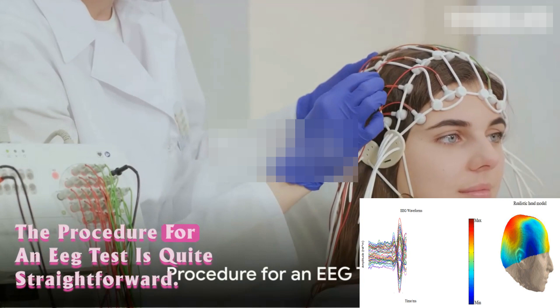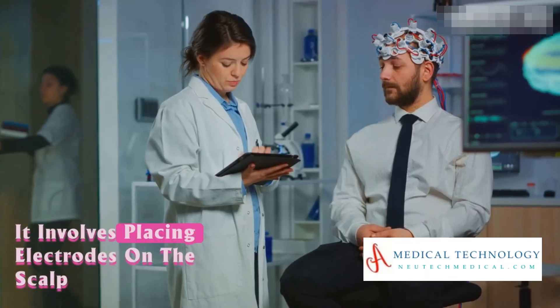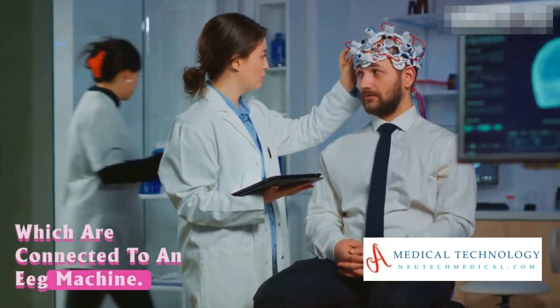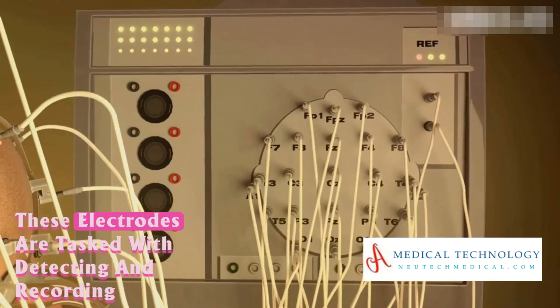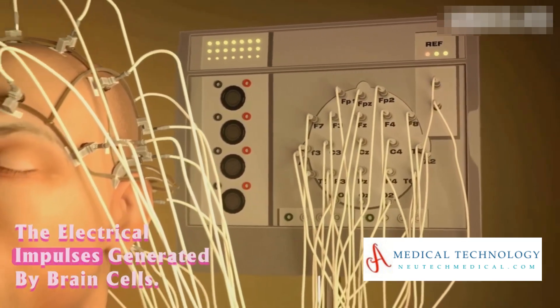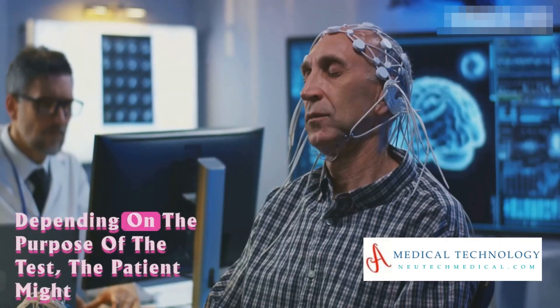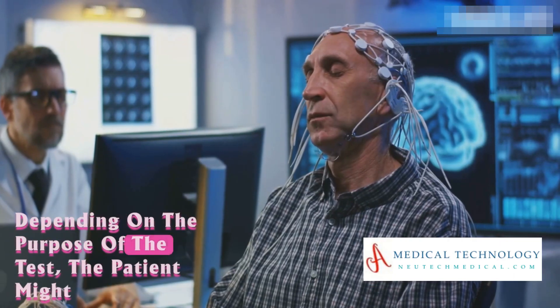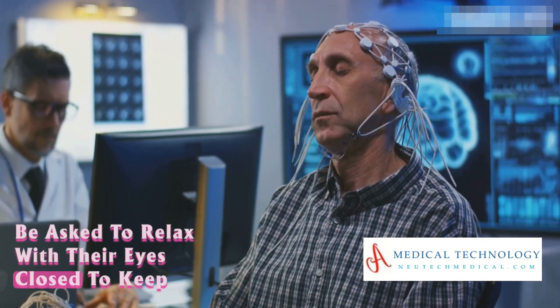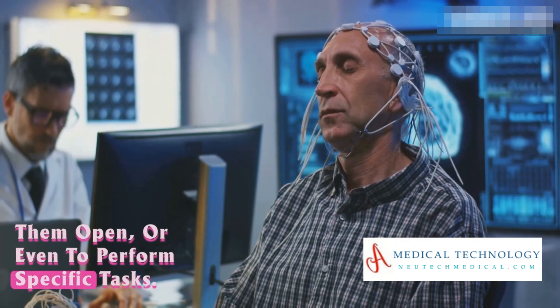The procedure for an EEG test is quite straightforward. It involves placing electrodes on the scalp, which are connected to an EEG machine. These electrodes are tasked with detecting and recording the electrical impulses generated by brain cells. Depending on the purpose of the test, the patient might be asked to relax with their eyes closed, to keep them open, or even to perform specific tasks.